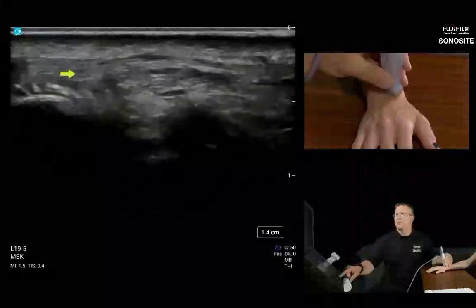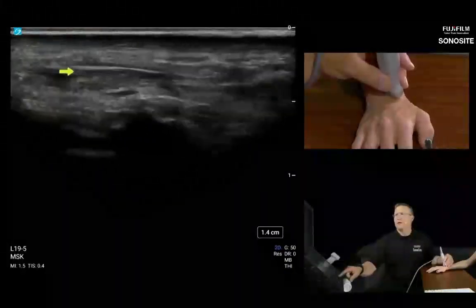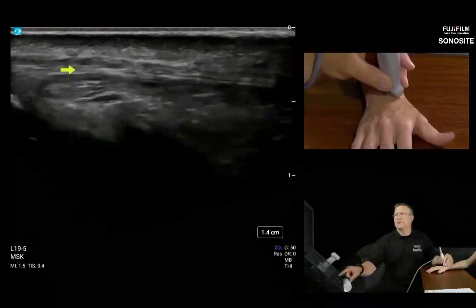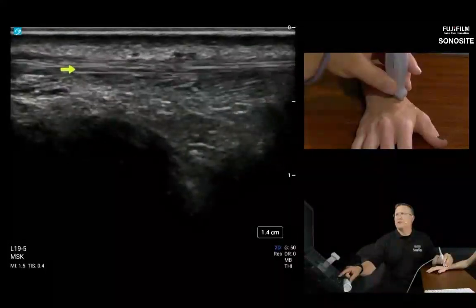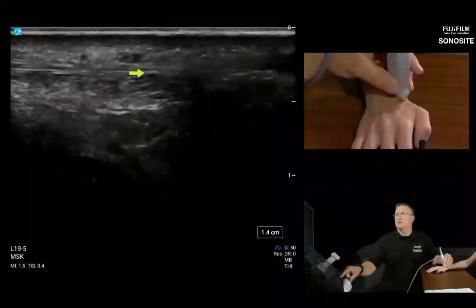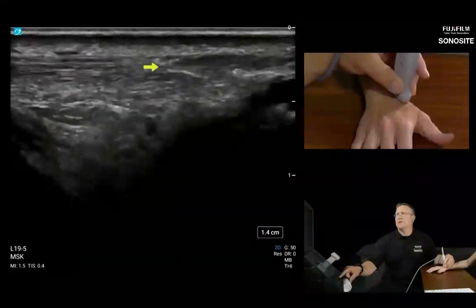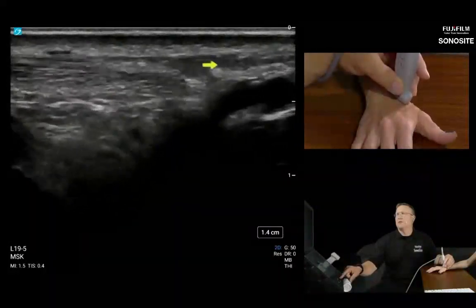I'm going to point the probe to the thumb, and I'm just going to have the patient slowly wiggle the thumb back, forth, flexion, extension, and I'm going to follow the flexion extension of the EPL. Still following flexion extension of the EPL. All the way.